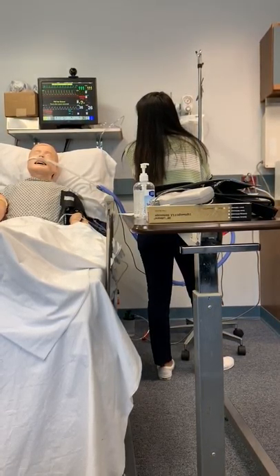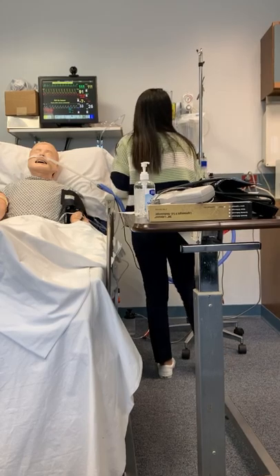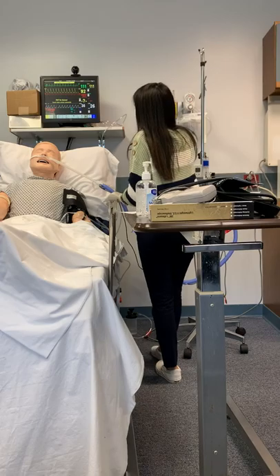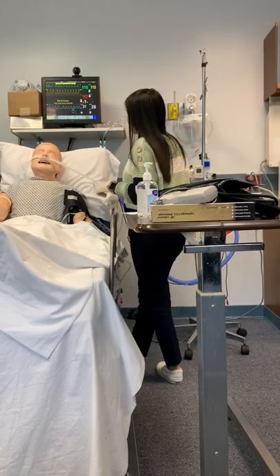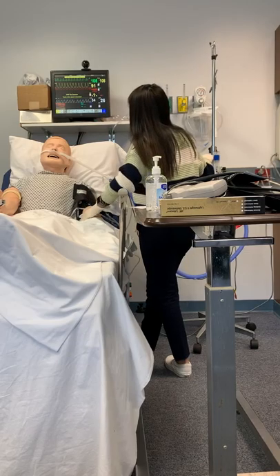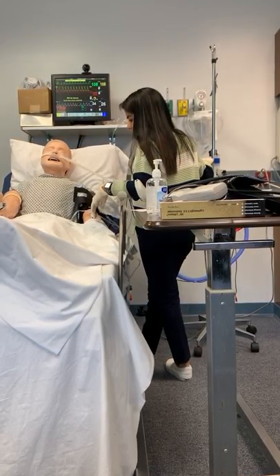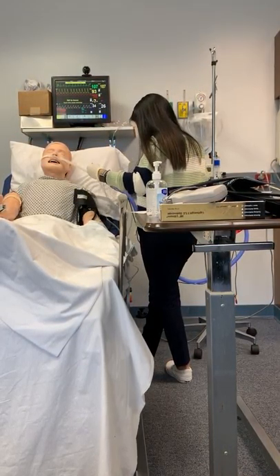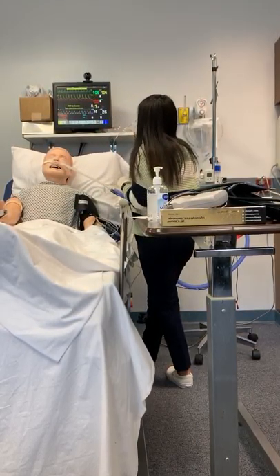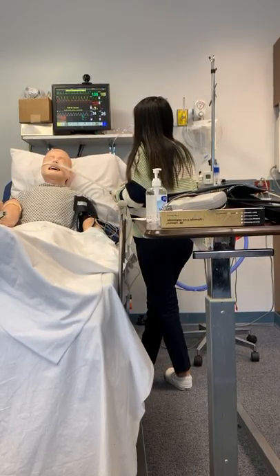Saturation is still working — it's going up, so it's getting better. Are you feeling a little better? You look like you're in less distress. Heart rate's going down. That's good.